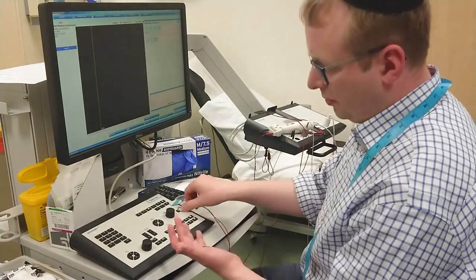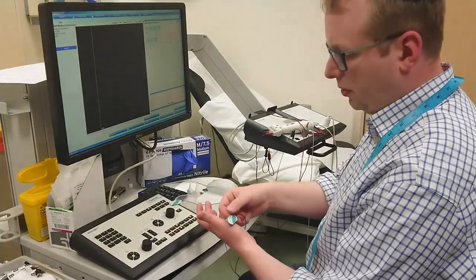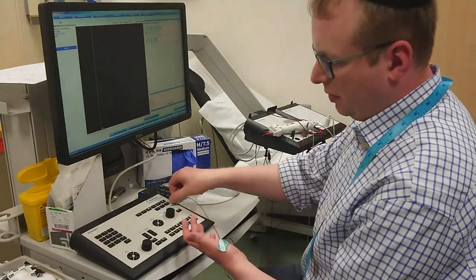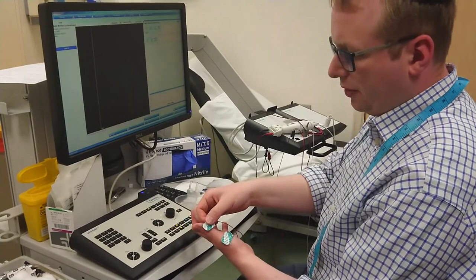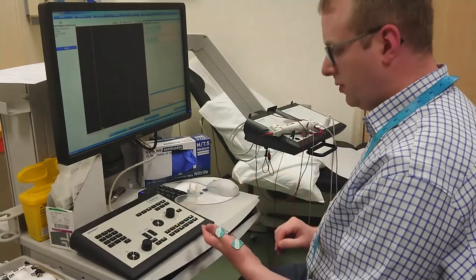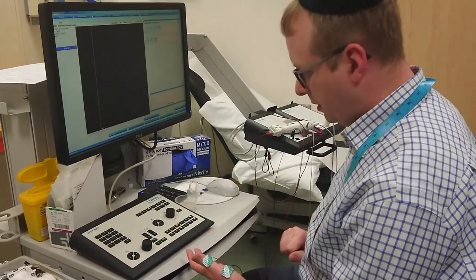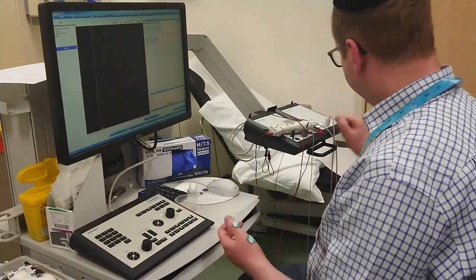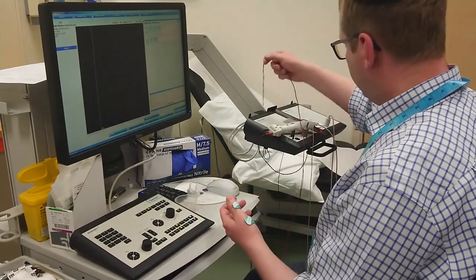So we always have the ground on, we put the active over the belly of the APB, indifferent over the tendon insertion.